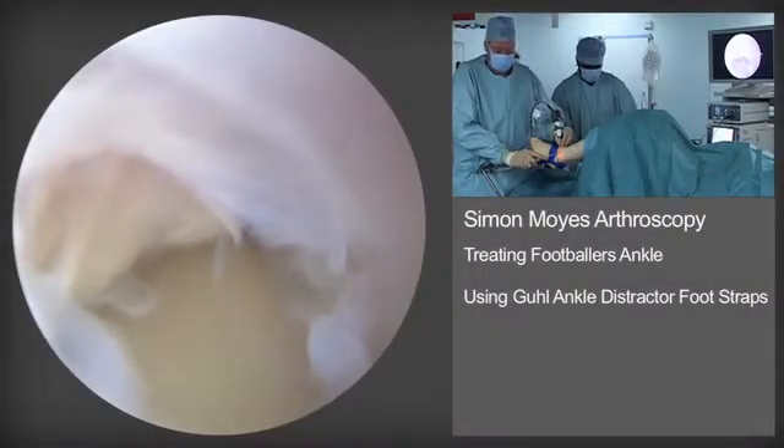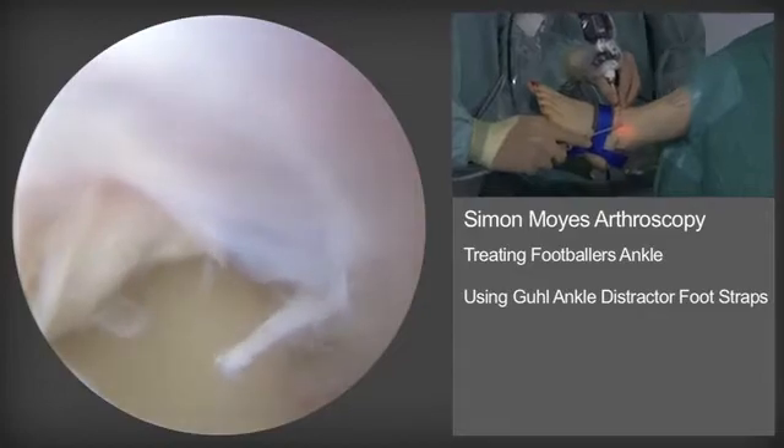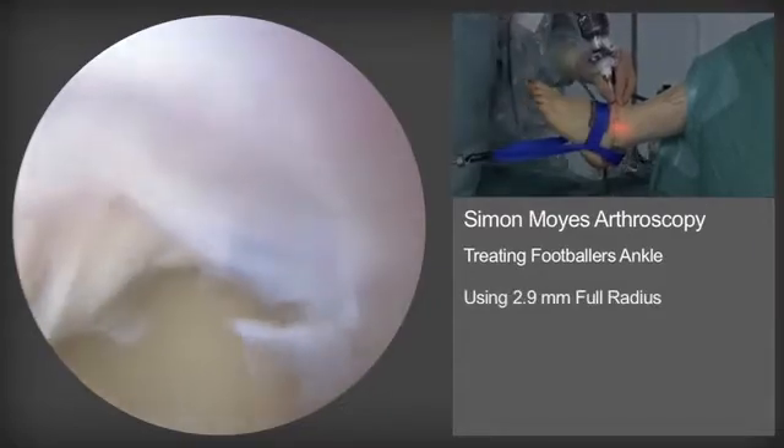Here is arthroscopic surgery of the ankle for footballer's ankle. The camera is viewing through the anteromedial portal, viewing laterally, and we've established an anterolateral portal, avoiding the superficial peroneal nerve.